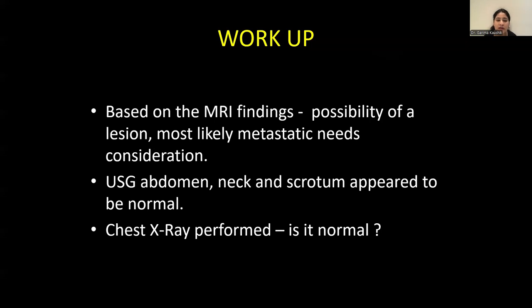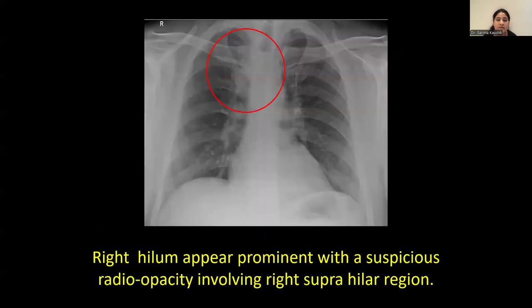Ultrasound of abdomen, neck and scrotum appeared to be normal. Further, chest X-ray was performed. In the chest X-ray, we can see the right hilum appears prominent with a suspicious radiopacity involving the right suprahilar region.